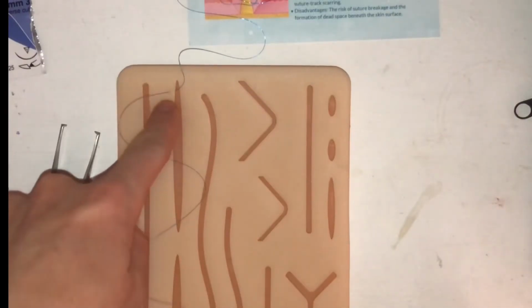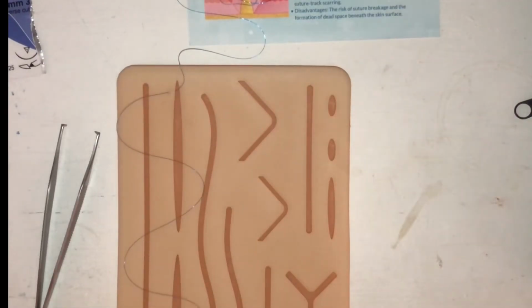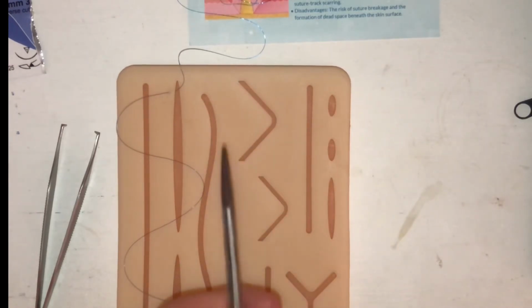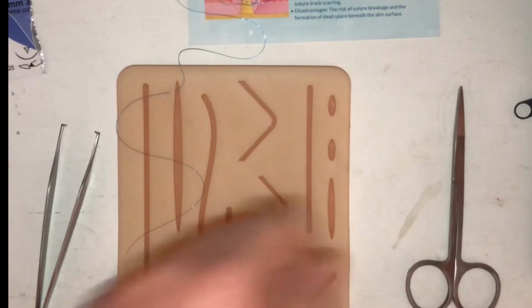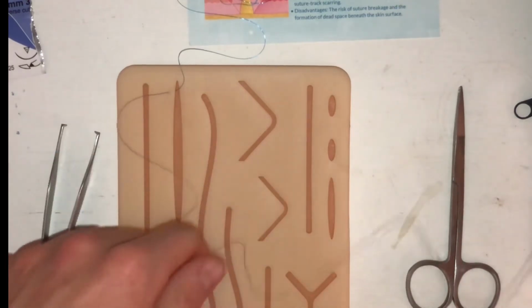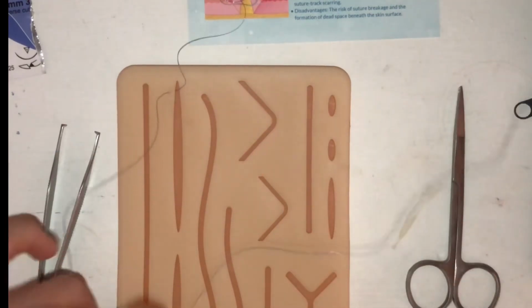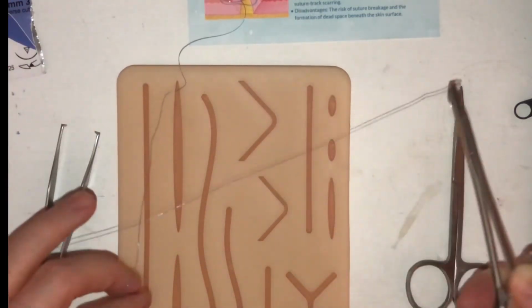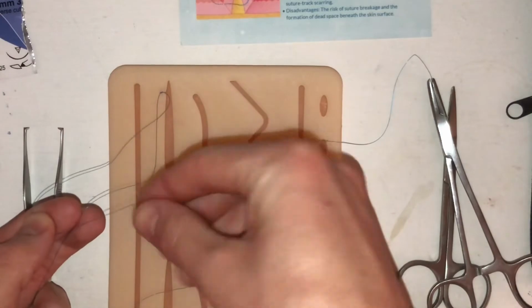So pretty much what they did was tie some knots down here at the base, then cut it off with, I believe, this tool. So we'll see after we tie it down, because he just said he wanted it anchored. So I guess I could do any type of knot. And I know, of course, I shouldn't be touching this with my hand. But, so I don't know if this is the right way to do it.